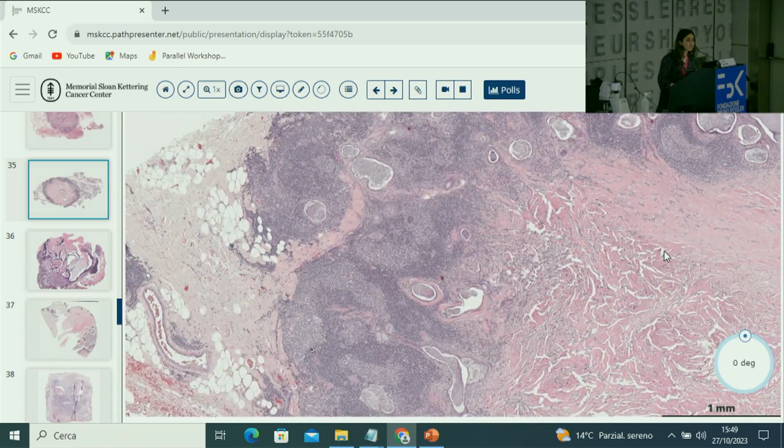When we use the three-tier grading system, it's actually difficult to grade this variant, because how do you grade this? Is it infiltrative? Is it solid? Is it cystic? What is cystic? So with the two-tier grading system, we did include the variant because it's easier. You don't have to comment on architecture as much. It's just mitosis and necrosis. So this represents a sclerosing variant of mucoepidermoid carcinoma.